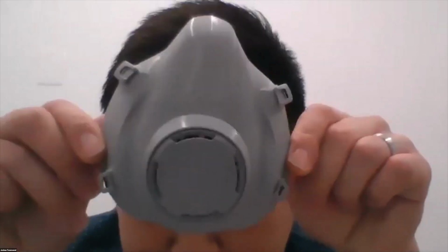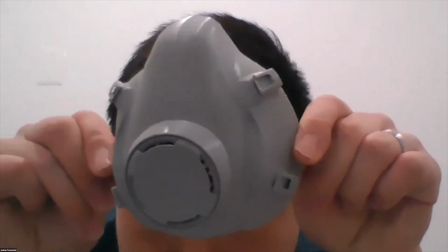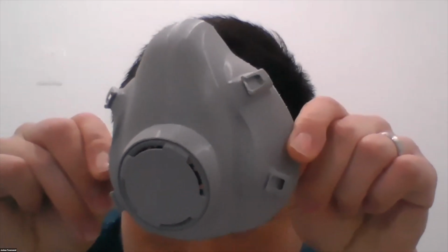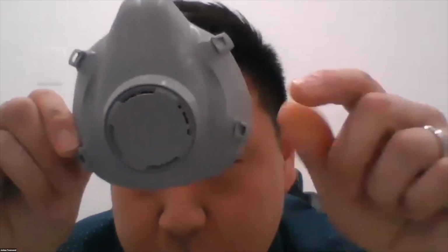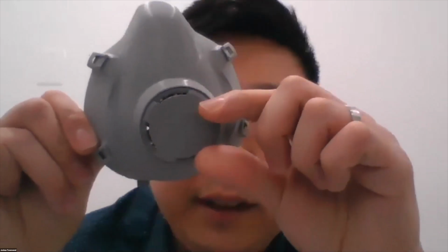So at this point, I can show you the history of our designs itself. This is actually one of our very first designs. We have a more aesthetic appeal for the shape of the mask itself. We utilized a cap attachment that was available over the internet.